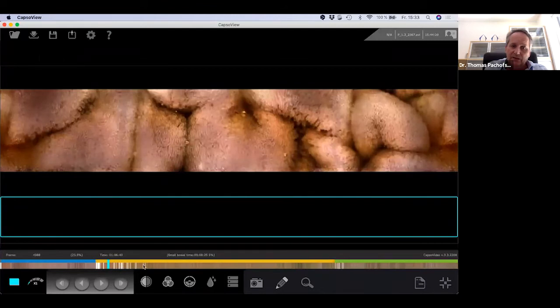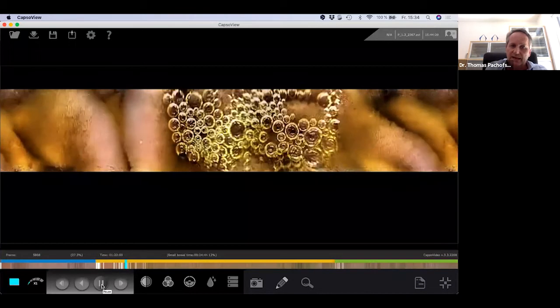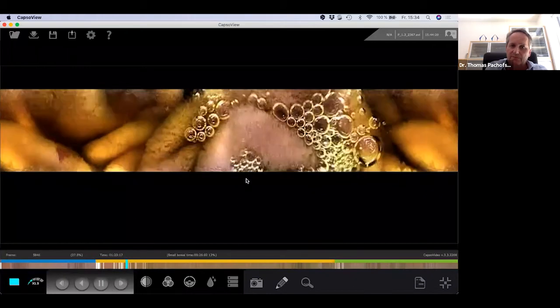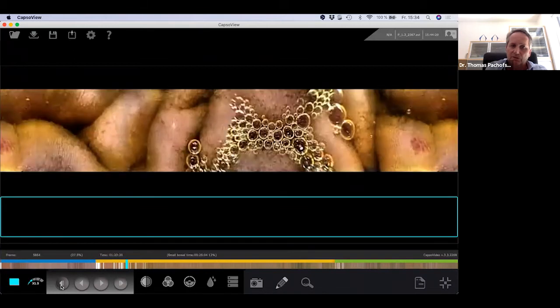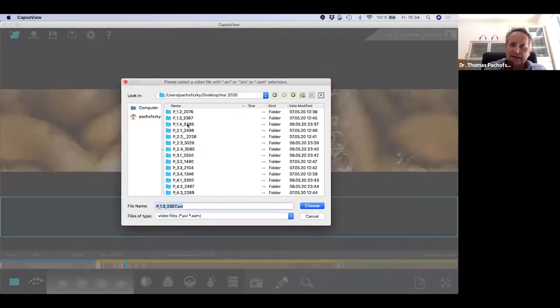You will get in your color bar, everywhere you have a thumbnail, those white lines, so you can easily know, okay, we are in front of one of these lines, and if I'm going on here, there must be the pathology, and here we have one, and here another one. So this was the first case. Many angiodysplasias in the small bowel for a patient with an ongoing bleeding. Then I will show you the next case.